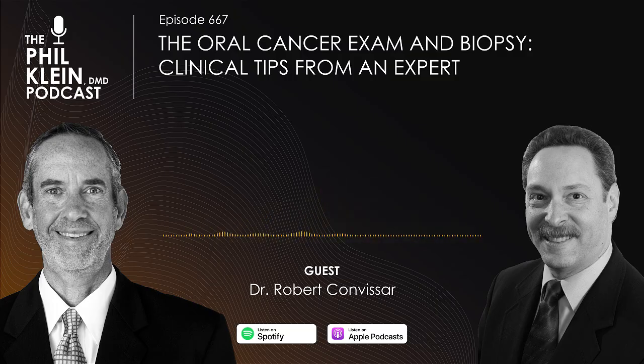There are a whole bunch of devices out there on the market, one of which is something called goggles, which look like protective curing light glasses. It's special lenses in these glasses that filter out certain wavelengths. And you can actually use your curing light with these special glasses to see if there is something worth biopsying or not. The important thing to understand, whether you're talking about any of these different devices, is that they do not diagnose cancer. They diagnose that there is something worth evaluating.